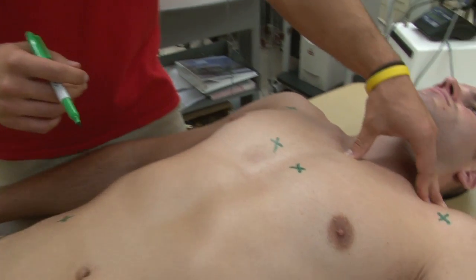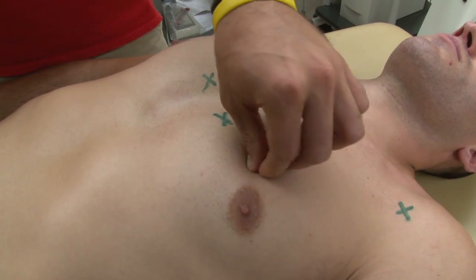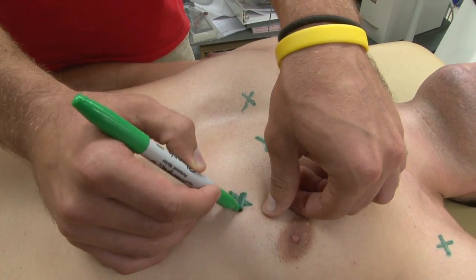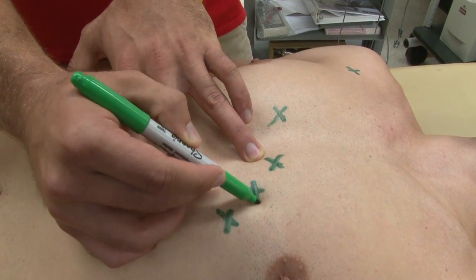Next, we're going to skip to the V4 chest lead. For that, you're going to go to the middle of the clavicle, palpate the middle of the clavicle, and that's going to be in the fifth intercostal space. Then we're going to go to the V3 lead, which is going to be in between the V2 and V4 leads — right in between those two markings.